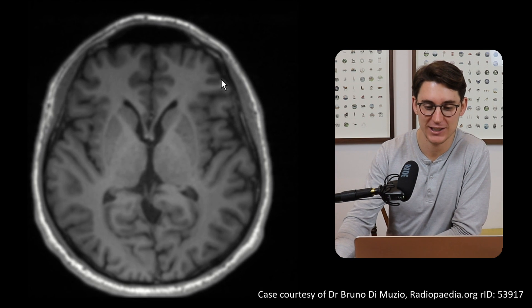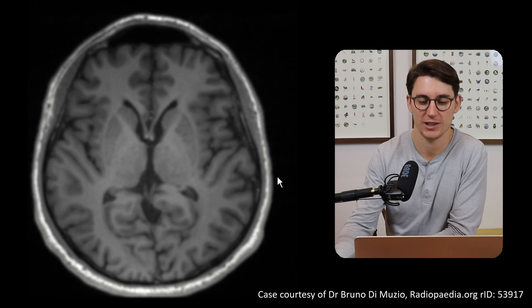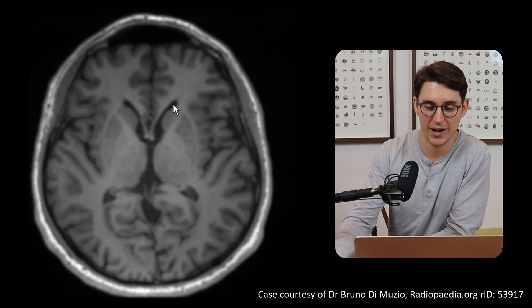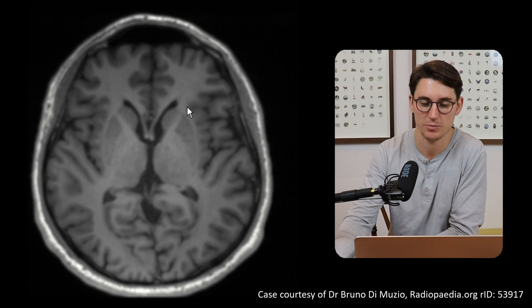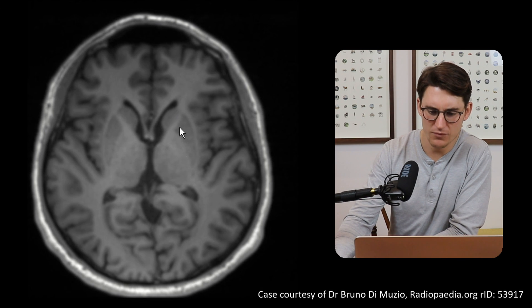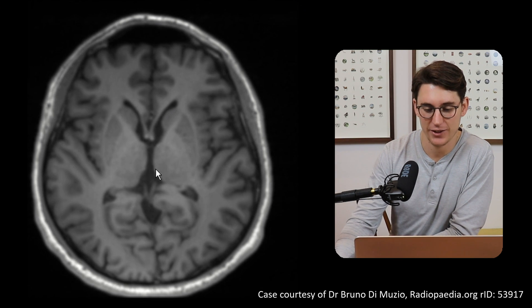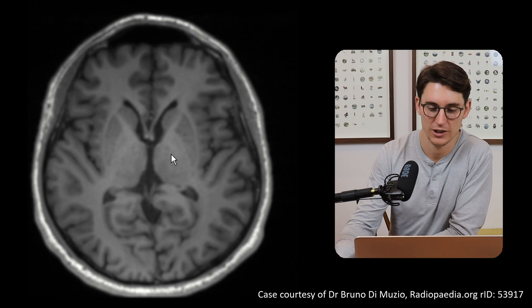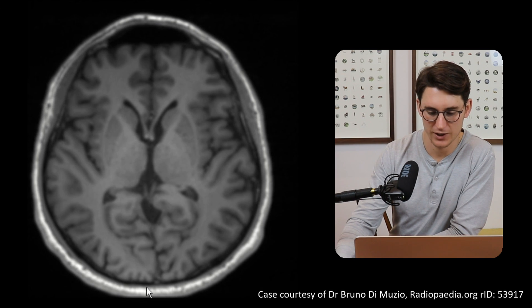Let's start by having a look at this T1-weighted MRI sequence. Before we get into the anatomy, let's orientate ourselves in this image and see which axial slice we're at. We're at the level of the lateral ventricles here, coming into the third ventricle via the interventricular foramen. We can see our internal capsule, the white matter tracts coming from the cerebrum down into the spinal cord, and our external capsule.